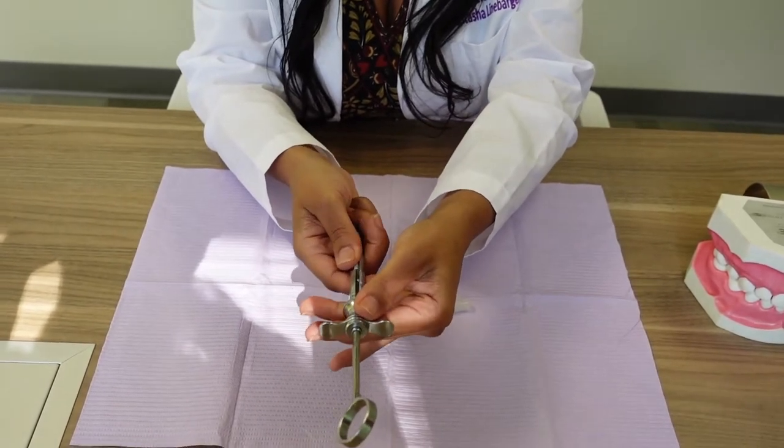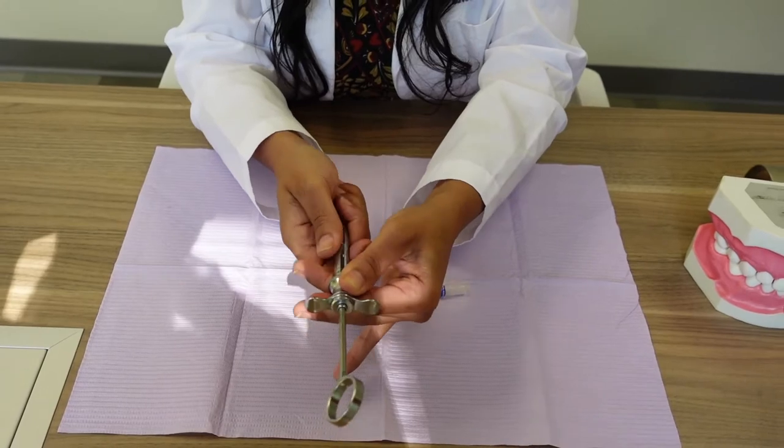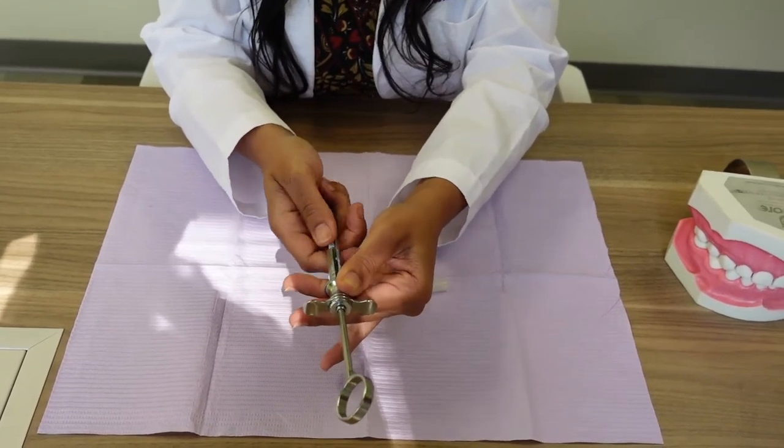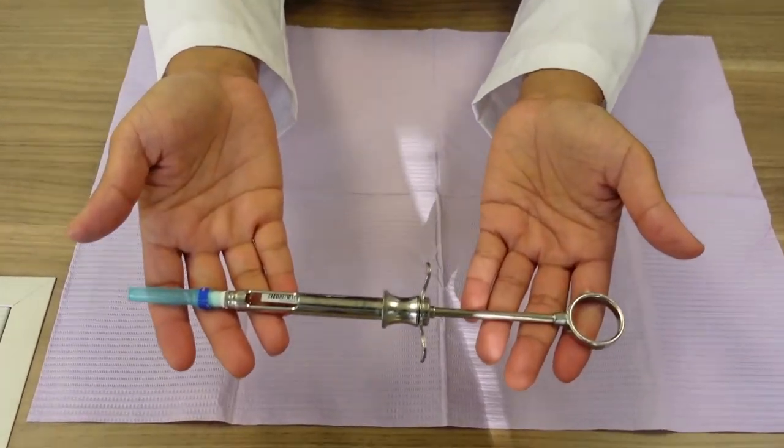When the doctor grabs for it, you're going to pull back and it takes the top off. You see that? It's like you're doing this motion. So that's how you actually set up an aspirating syringe.